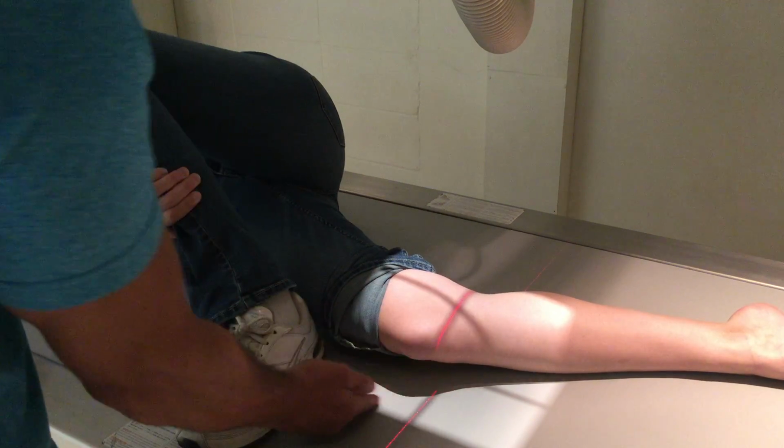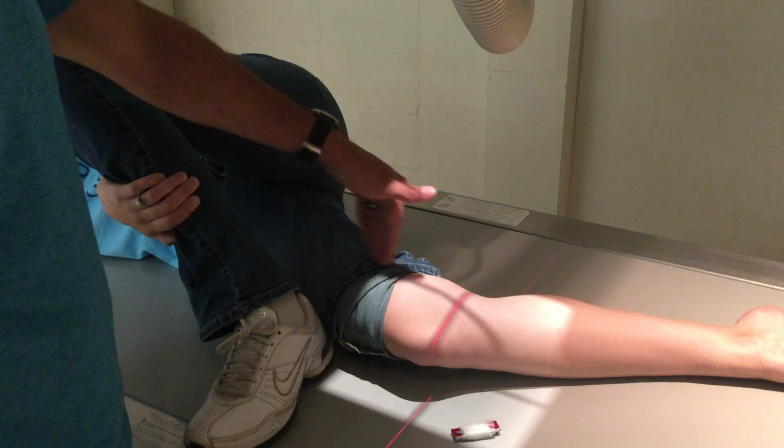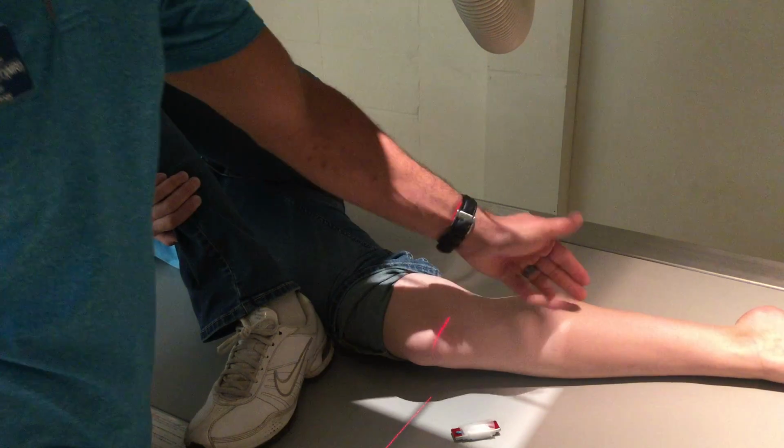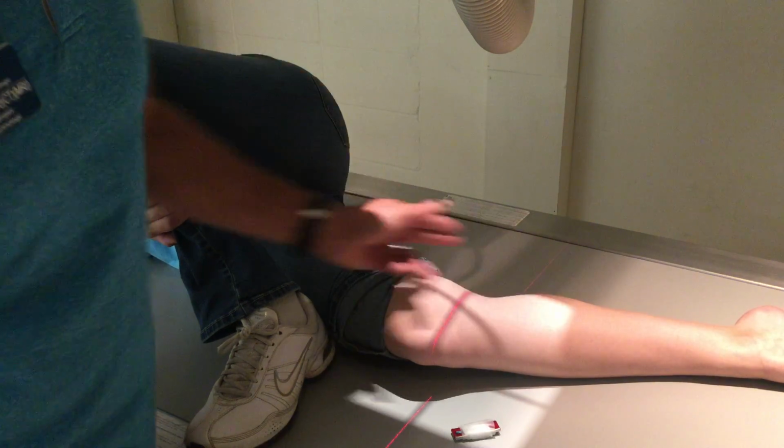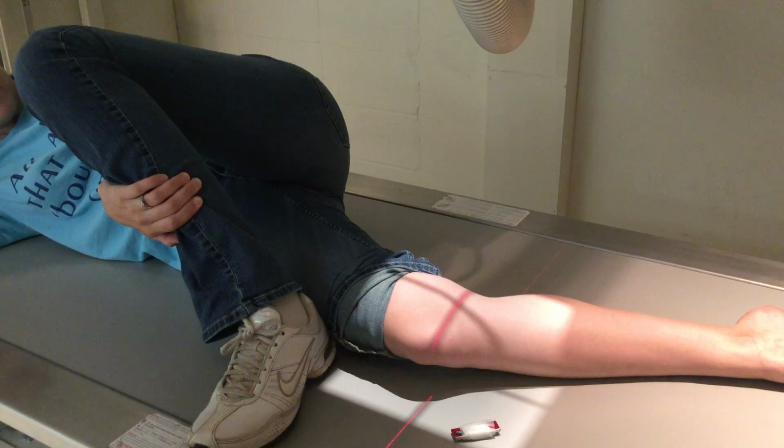You want to project this, remember you've got an angle, so it's coming up. So you want to go through them, mark anteriorly. The big thing with this is this will come almost straight down the femur, and this will come out the edge of the tibia. So that's a pretty good angle. It gives you the right space with the patellofemoral space. And then you just kind of drop down and take a look at what you got here.